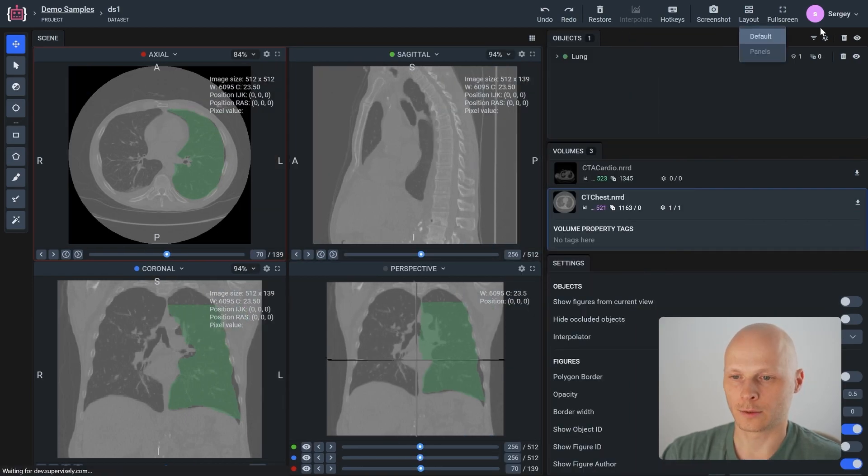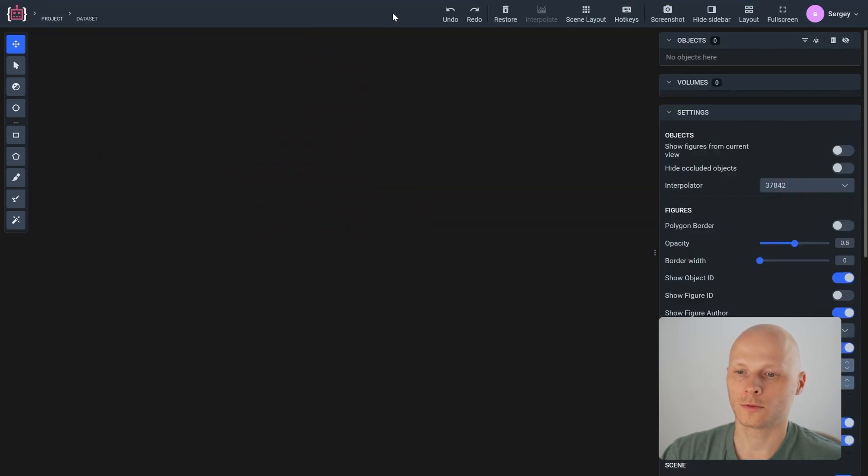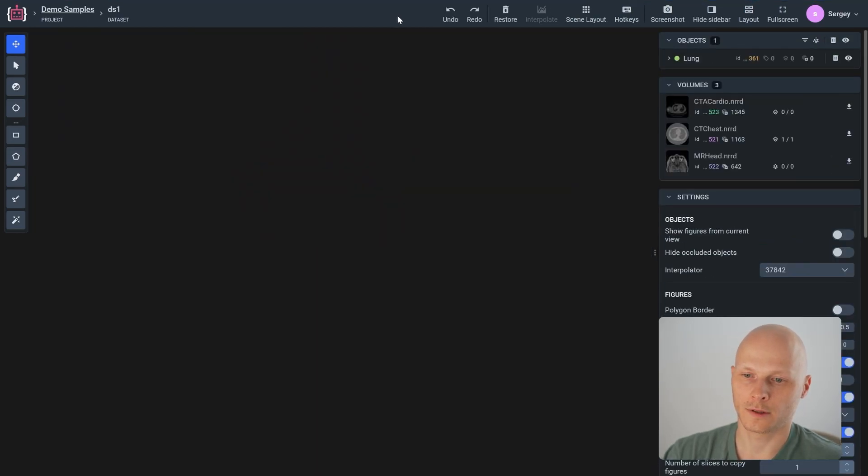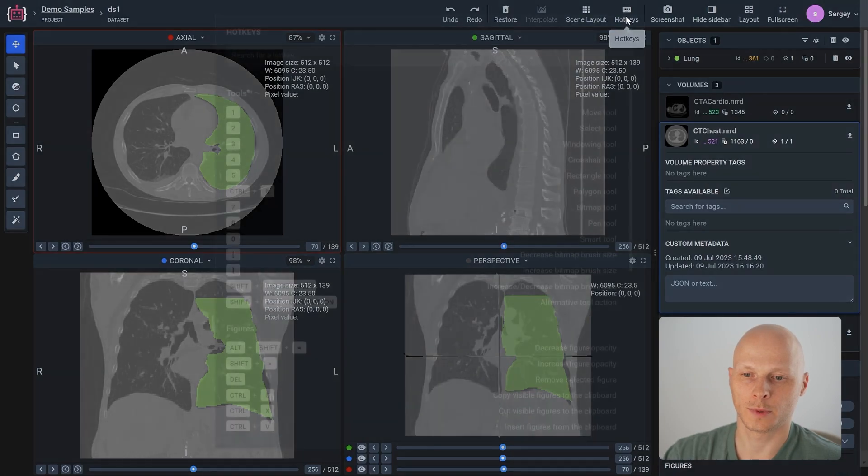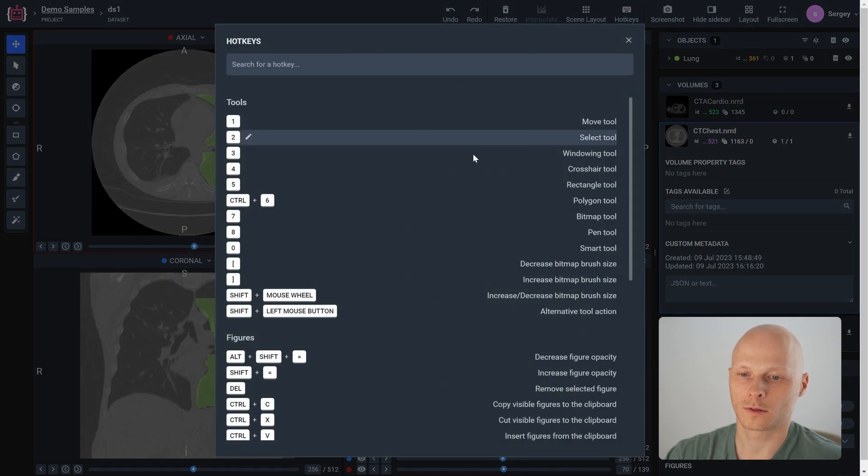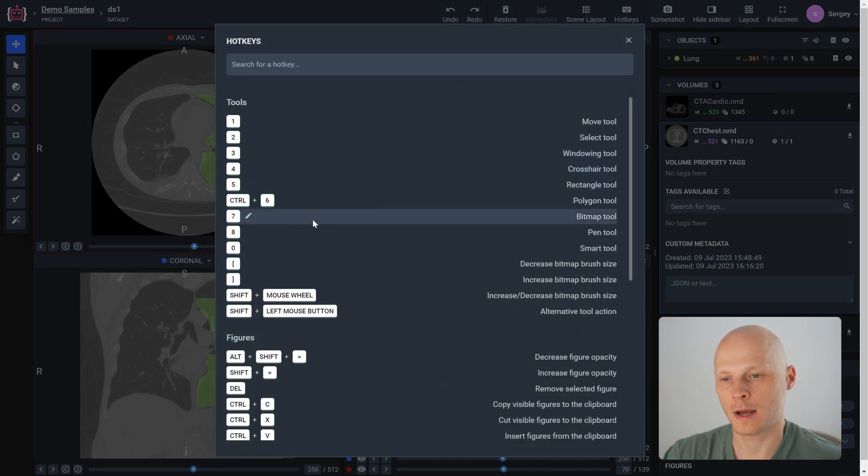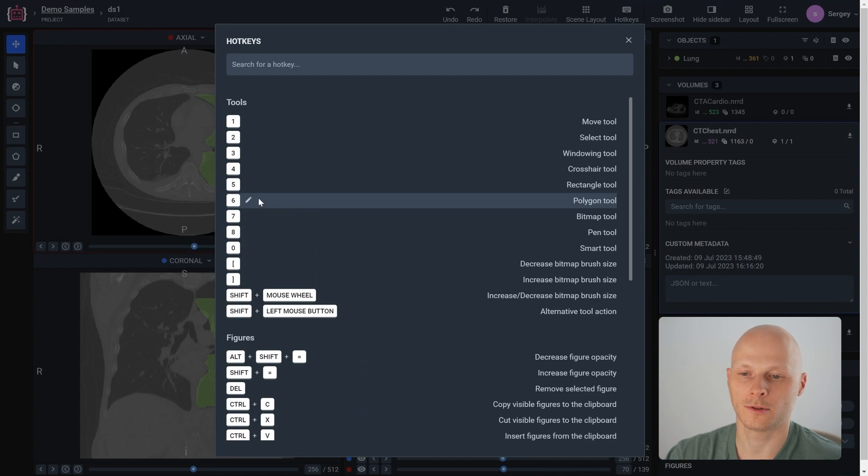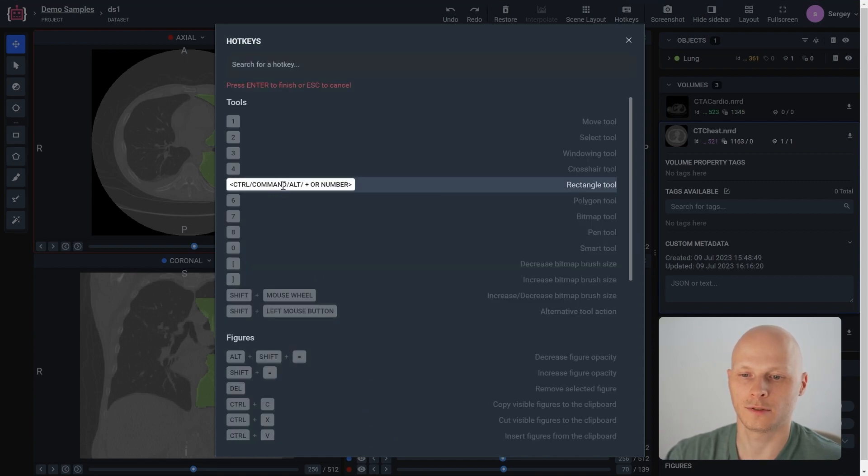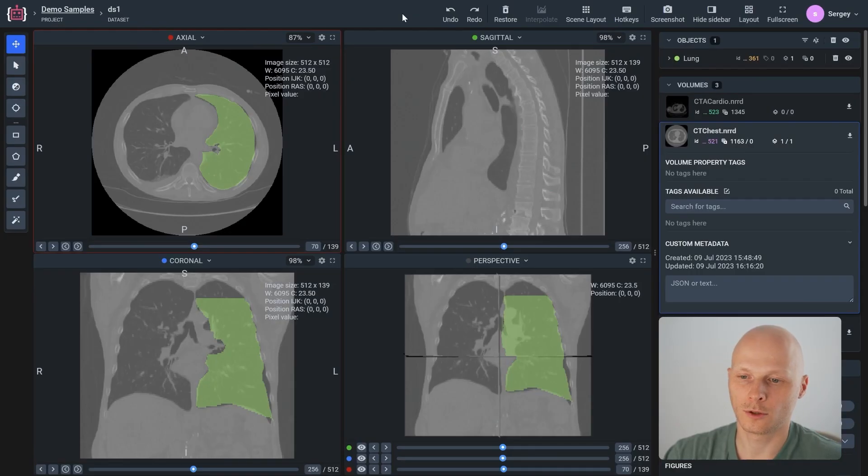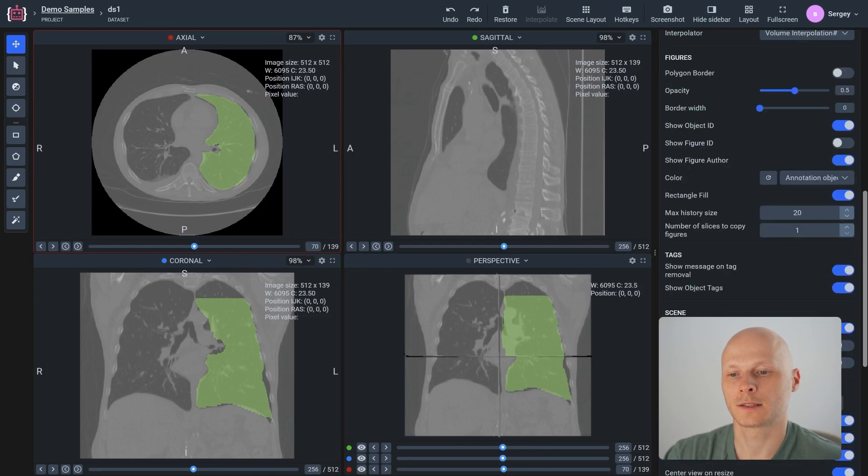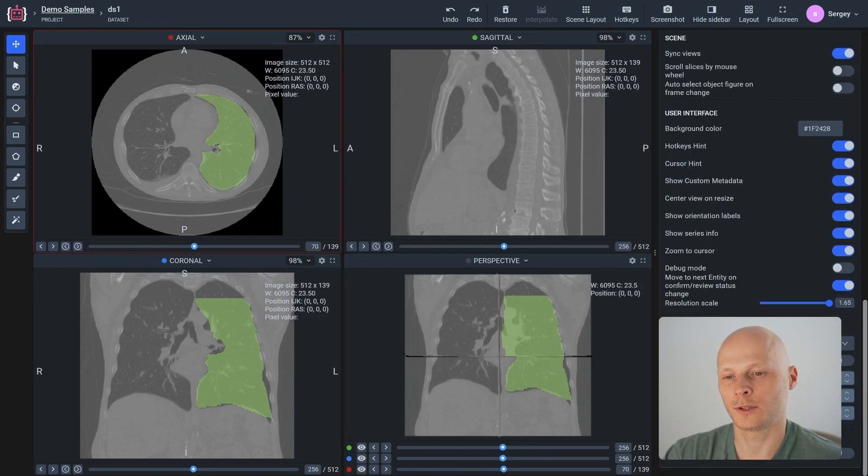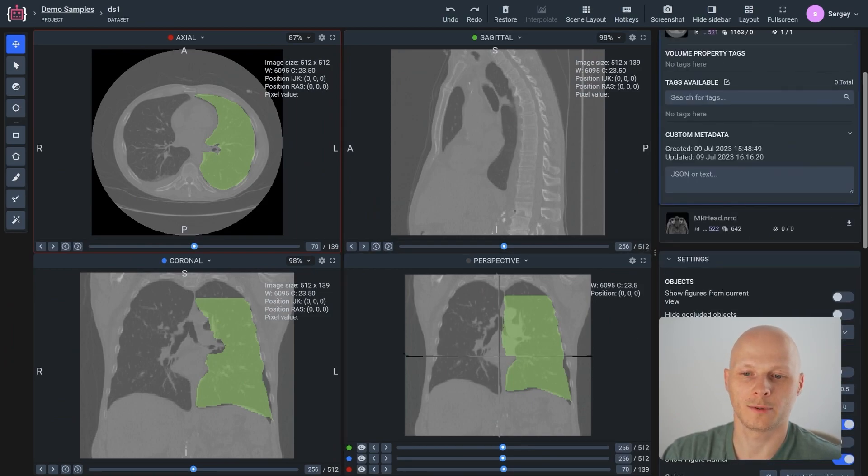It's also important to note that we have a variety of hotkeys to speed up your work and they can be customized. Physicians can adjust them to match what they use in their medical tools. We have a lot of other settings that you can explore in our blog or documentation.